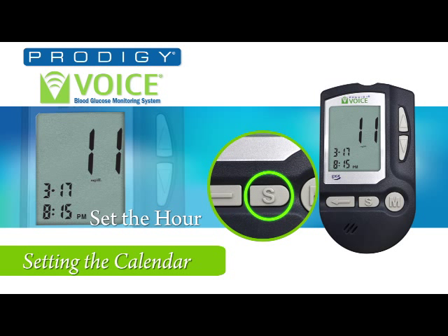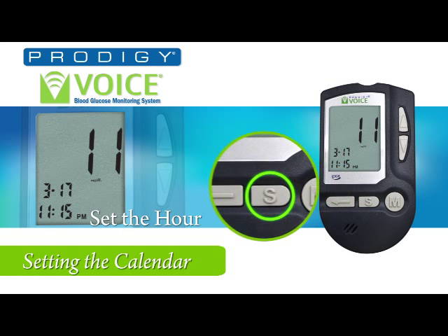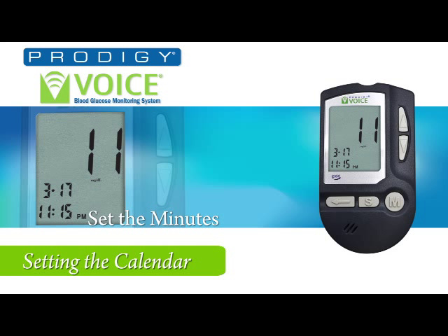Press the set button to set the hour. You will hear: 'The hour, 8 PM.' Now press the up or down buttons to set the hour — 9 PM, 10 PM, 11 PM. Press the set button to set the minutes. You will hear: 'The minute, 15.' Now press the up or down buttons for desired minutes — 16, 30.